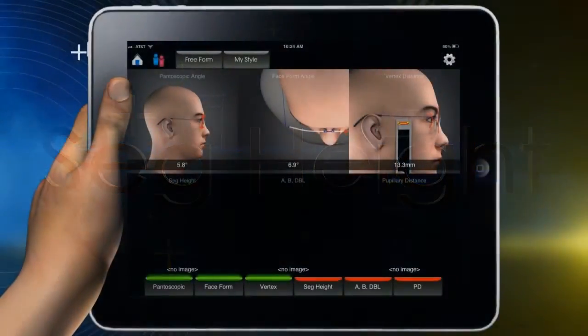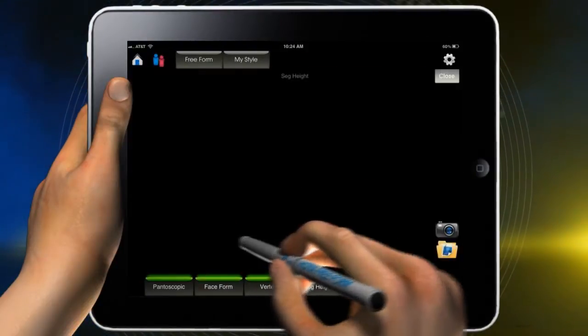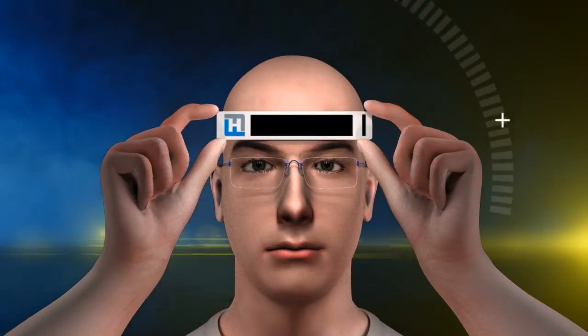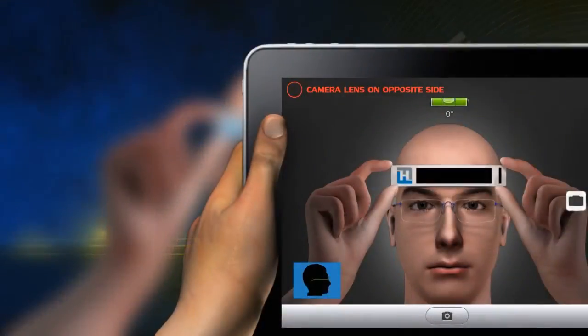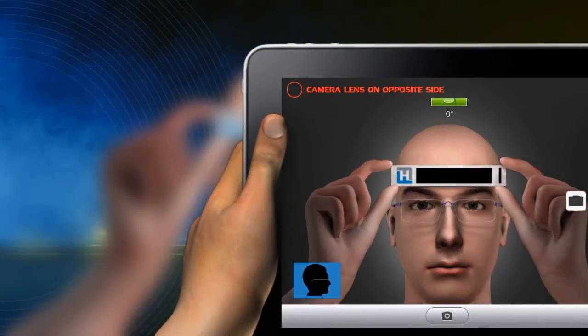Once taken, all three of the photo placement boxes will appear with the same photo. Have the patient hold the lock-on device with both hands as shown. Position the patient approximately arm's length away from the camera. The iPad camera lens is offset, so position the camera lens on the nasal bridge and have the patient look straight ahead.